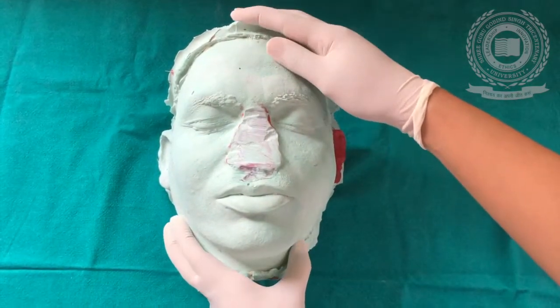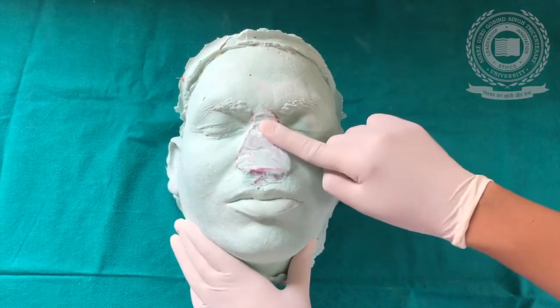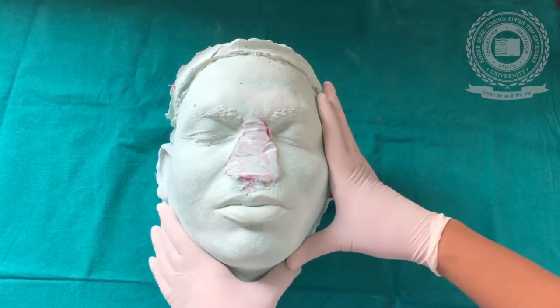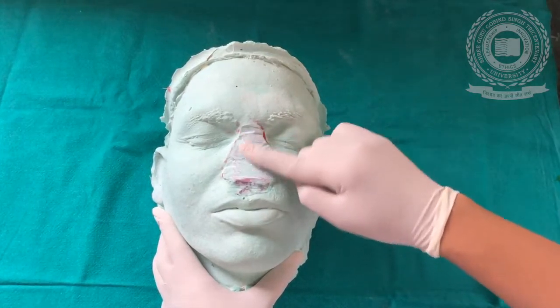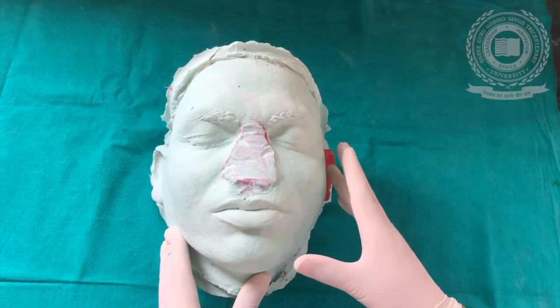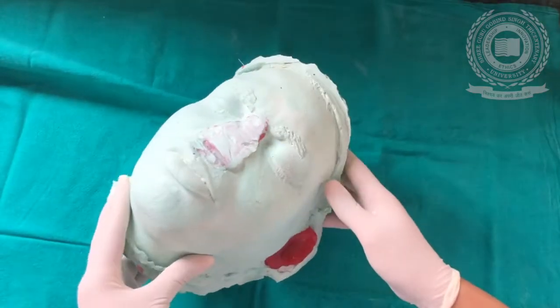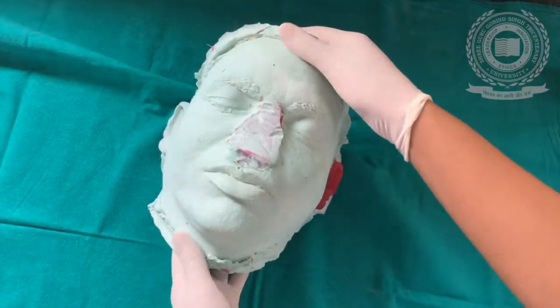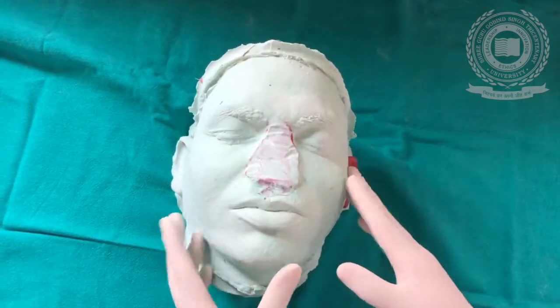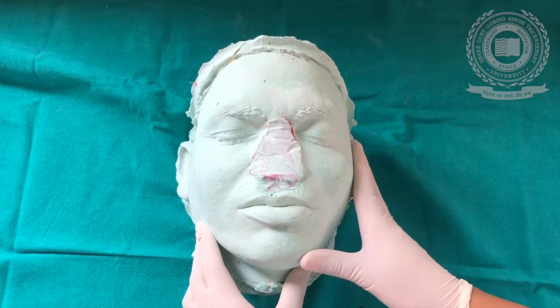From the impression we get a mold cast like this. We have removed the nose from this cast because we are going to fabricate a nasal prosthesis for this patient — this is a demo model. So we have cut out the nose from this model. This is how we have poured the cast — the impression made with alginate and poured into dental stone. We can also replace the ear of the patient, or any maxillofacial or mandibular prosthesis can be fabricated and its relationship checked with other external structures of the facial molage.